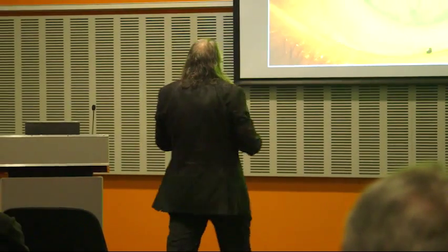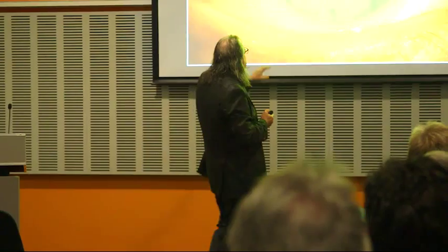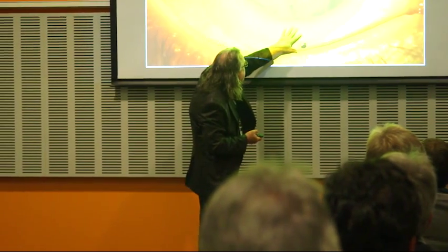Now, what are the advantages of this? Well, number one, I believe by putting toricity into the back of the scleral lens, we can now take the weight of the contact lens, instead of distributing it all along one meridian, we can more evenly take that weight, pressure, bearing of the lens and distribute it more equally around the sclera.